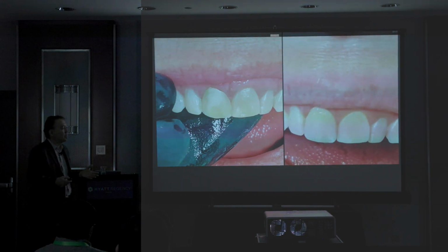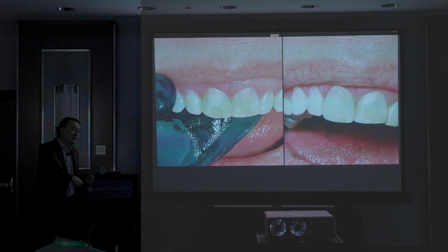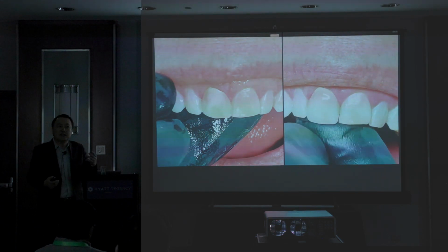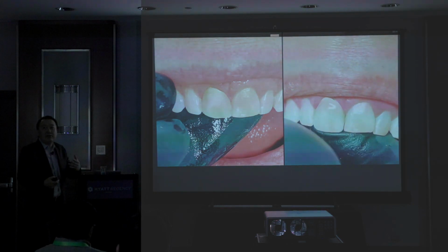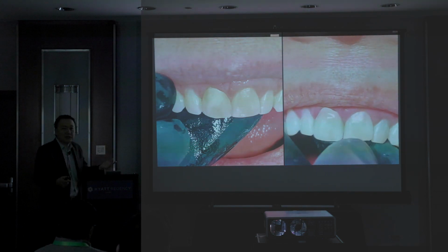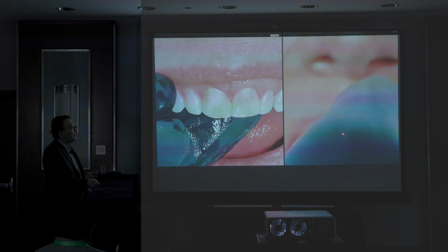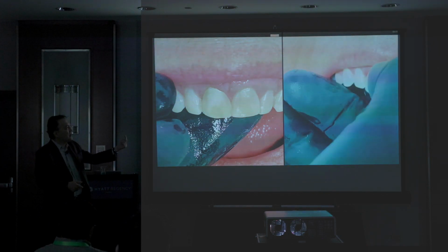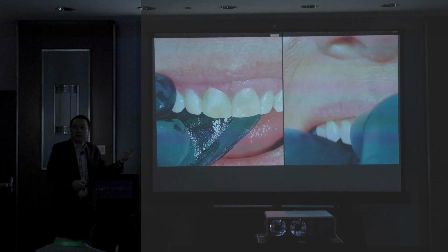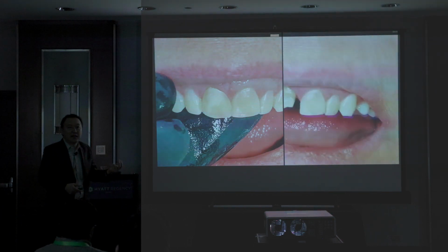Sometimes with the patient, it's a game anyway, a human game. The dentist sends the photo. Sometimes I make a mistake. Sometimes the photo is not as good as what I'm looking for, so I fabricate it and it's not right. So the patient comes back to our laboratory. Of course, I charge them. And then I spend time with the patients. And then here, toward the lingual, I cut it. I'm trying to take it out. Is it luck? Probably 60%. 30%, I cannot take it out.